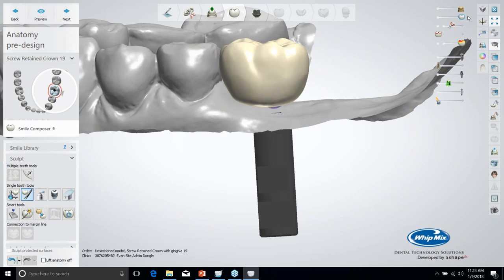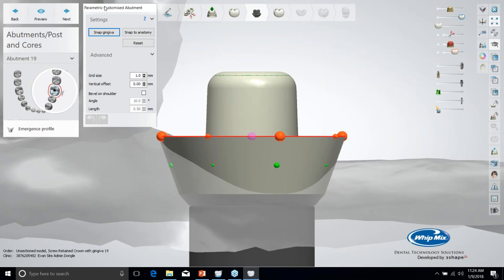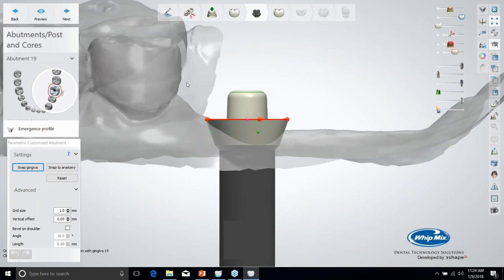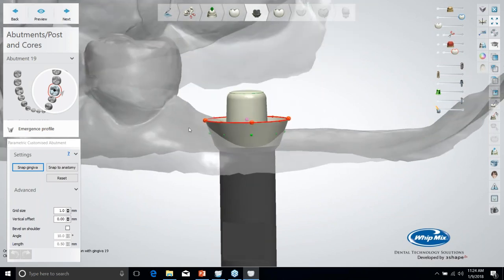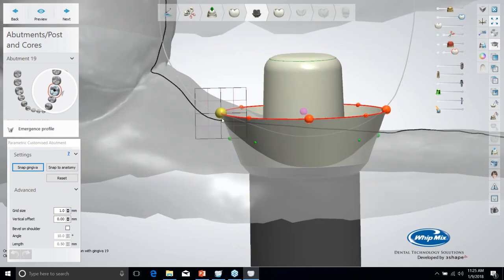So now we can go ahead and go next, since we have our pre-design done. Now what we're doing is designing the emergence profile of the screw retained crown. If you've done any kind of abutment work in 3Shape, this will be familiar to you. If you haven't, really all you're going to be doing is clicking, and on each one of these orange balls, when you click on it, you get a grid. That grid, each little square is 1 millimeter. So this is to give you an idea of depth or how much you might be impinging on tissue.